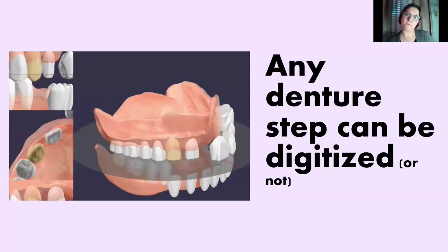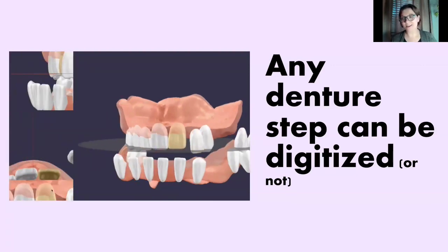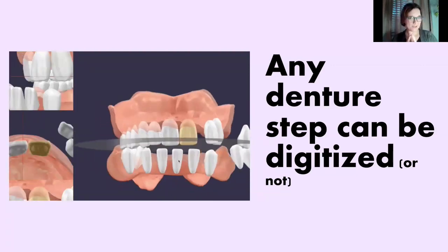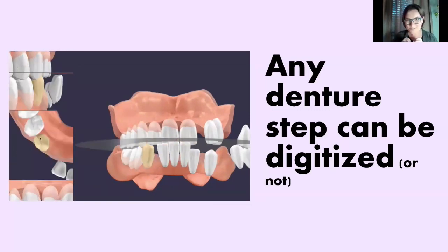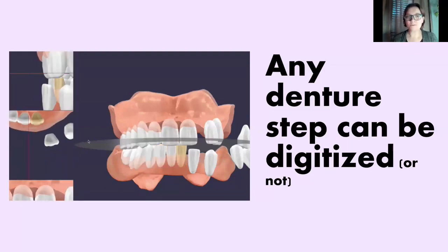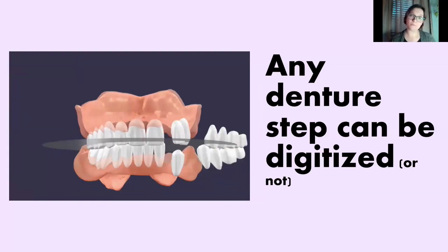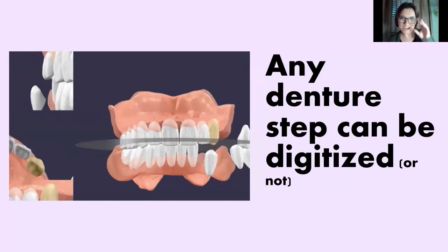today, any step of dentures can be digitized or not digitized. And I think this is really exciting as a prosthodontist because you might know that many of us are a little bit type A. We like to have control over different aspects. And there are some cases that I want to use a face bow. There are some cases that I want to do lateral check bites and protrusive records and set my articulator. Sometimes I'll use a Kadiax and get a little wild and do some jaw tracing. Sometimes I'll use green stick compound. So I can take any of these conventional steps I want and incorporate them into a digital workflow.